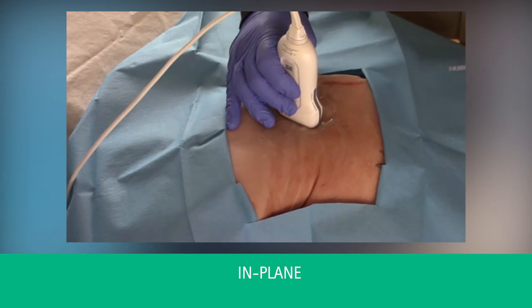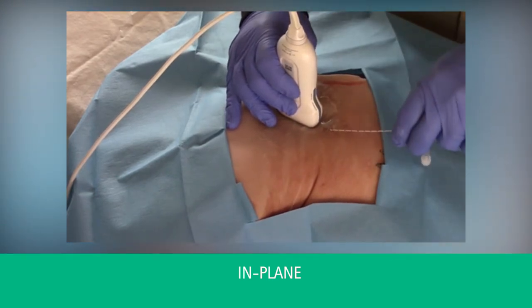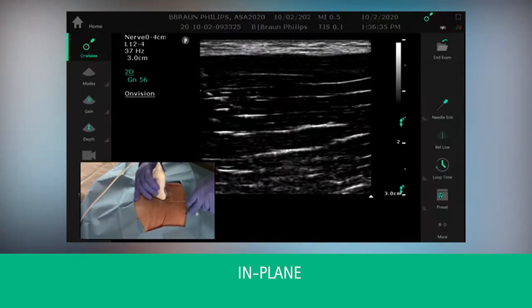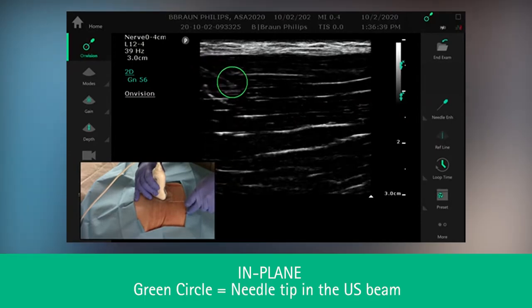Once you identify your anatomy, line up your needle with your transducer, advance your needle, and as you advance the needle, the OnVision technology will automatically display.